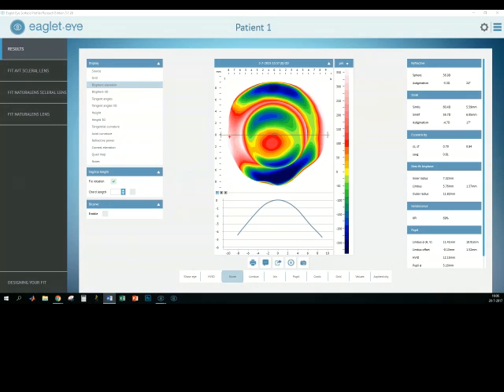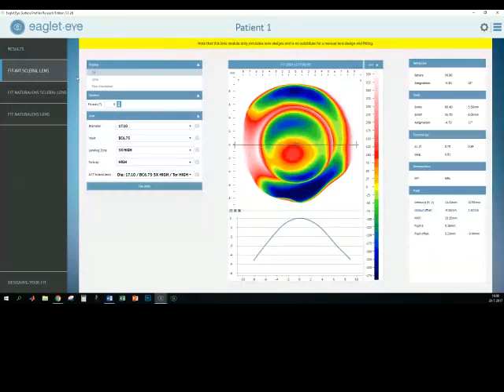What more we can see is that the horizontal axis is the flat axis, because this is the red horizontal meridian. And we can also see quickly that this is the steep axis, so this is clearly scleral with a toricity. Well, we've created just a simple algorithm to help you get there. You just click the button and you get the advice immediately. Let's see what's in there.